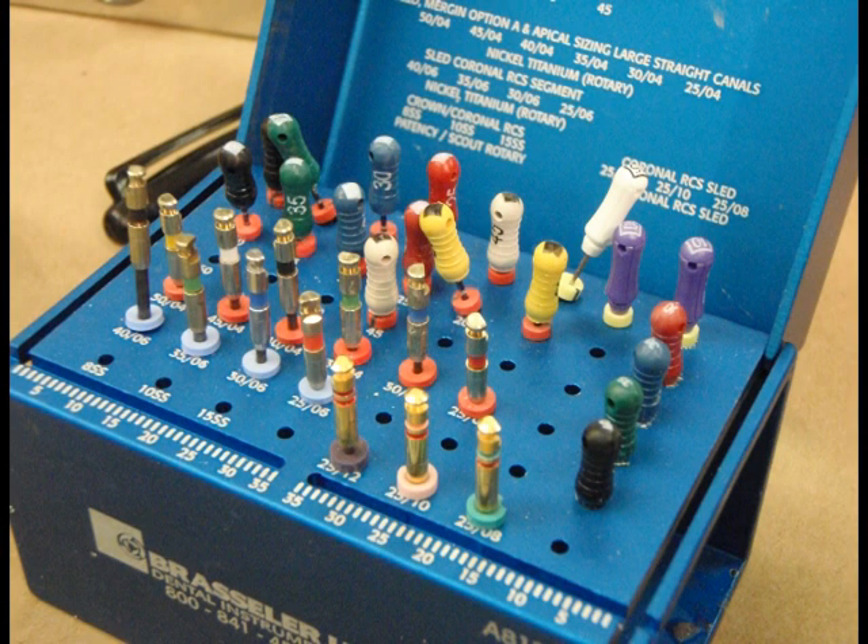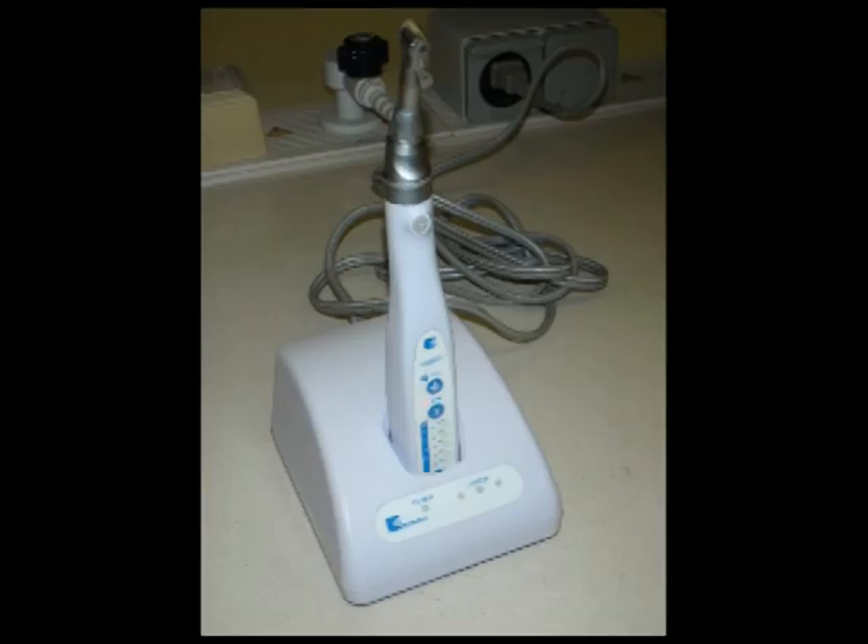We will now shape the canal by using hand files and a rotary handpiece in the standard crown down technique.